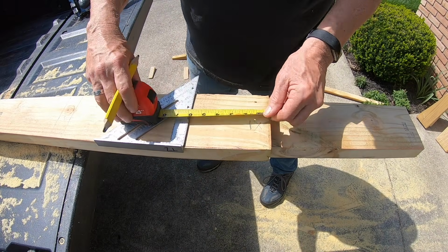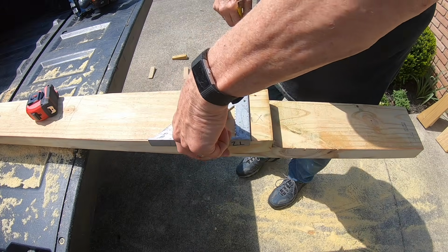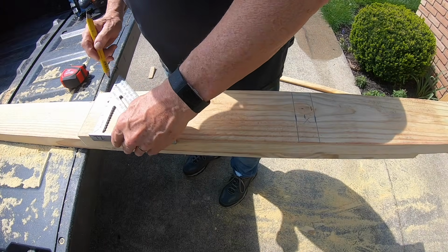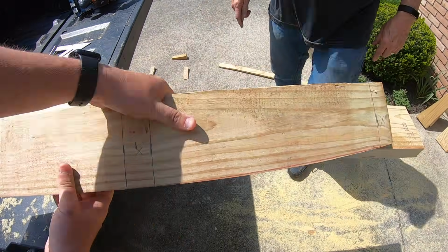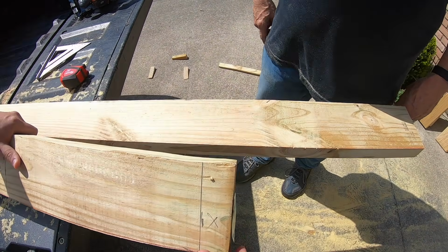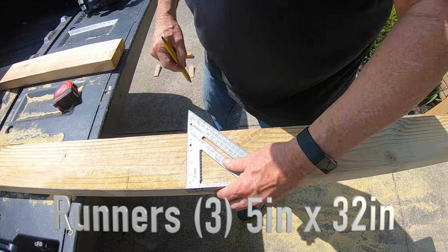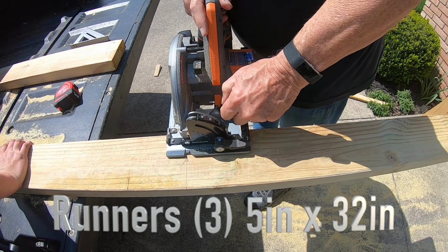Just like that. Then you're gonna go ahead and take your square and draw your line, and same thing with down here, 1.5 inch as well. And this just kind of saves you some time later, because then your header is all set up exactly how you need it, and you know exactly where those boards are gonna come out, and that's what you need. It's 3 at 32, so you're gonna go ahead and mark it. You go ahead and draw your line on there to make sure it's nice and straight. Then you can go ahead and take your saw.